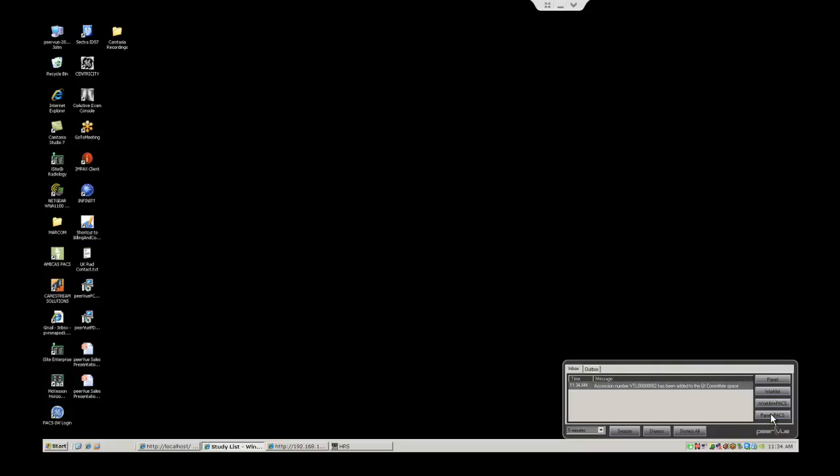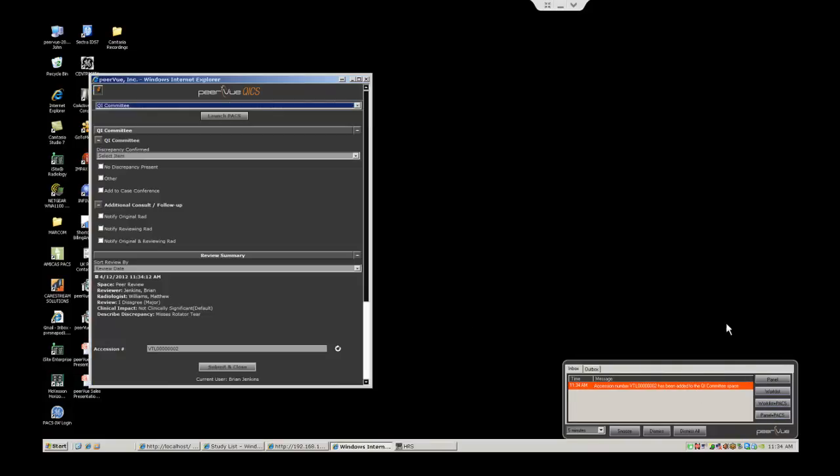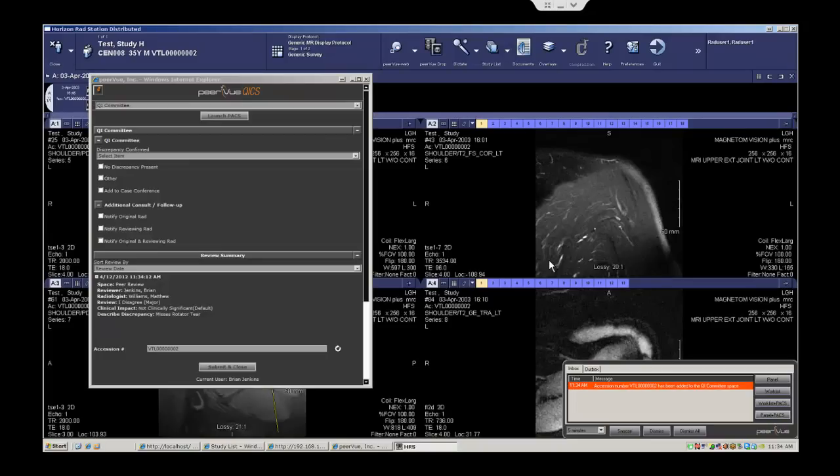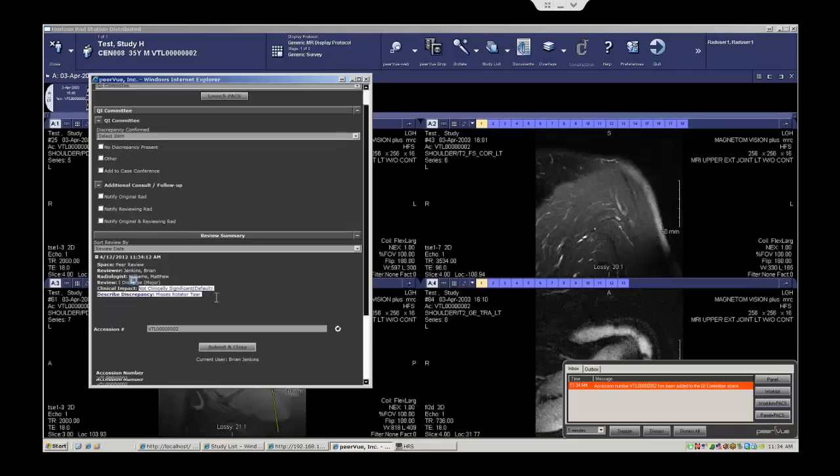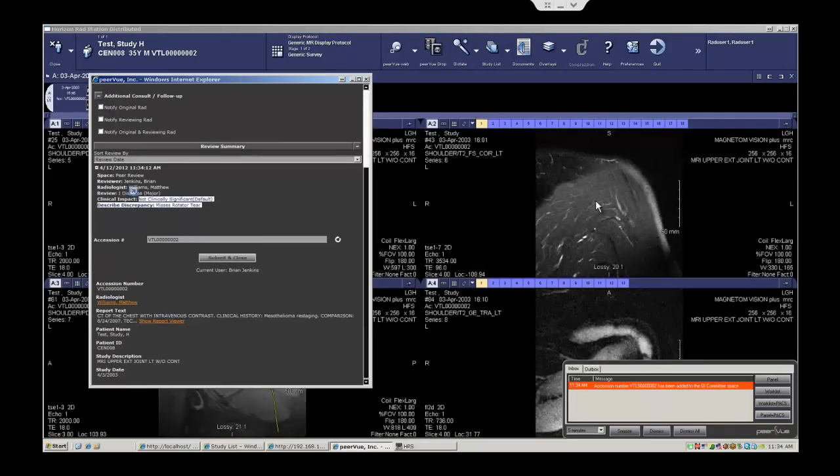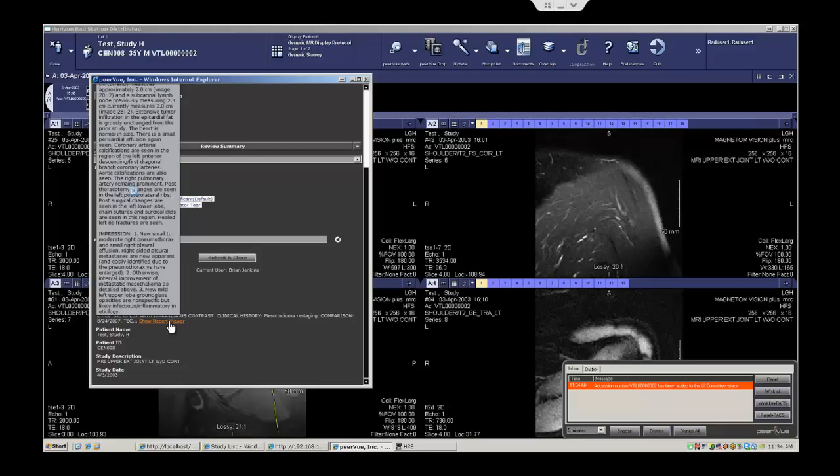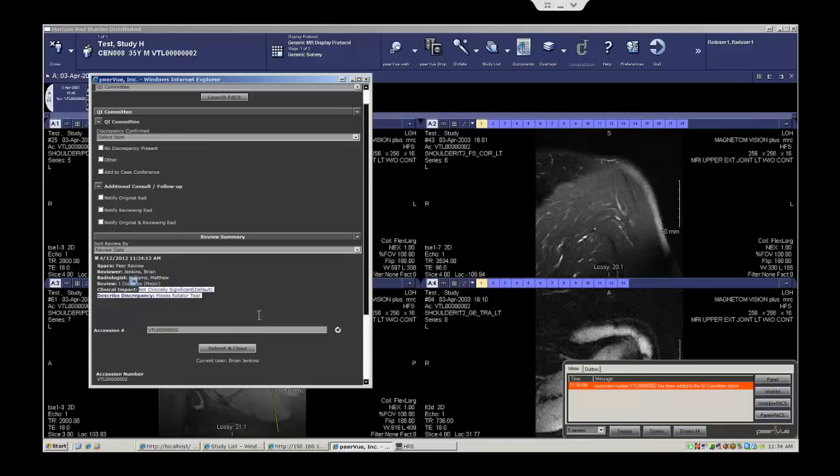From the alert itself, they have the capability to launch both the panel and into PACS, see what the discrepancy was, have access to the images, have access to the original reading radiologist report, and the capability to give the appropriate feedback.